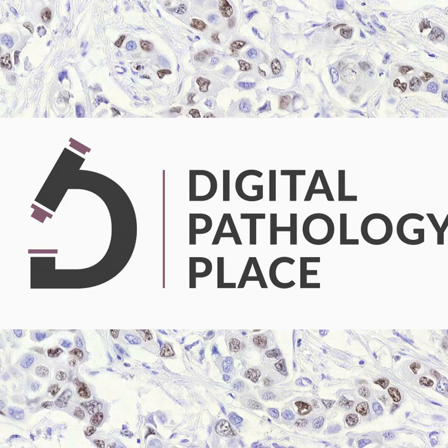This approach can be especially useful in the presence of large data sets that would be time-consuming and expensive to annotate everything manually. Side note, if you remember the blog post that was part of Chapter 1, a software that includes this type of learning is the Studio from Pathology, and also the image analysis platform from a company called Aphoria has this feature. These are the two ones that I know firsthand. Probably there are many more.